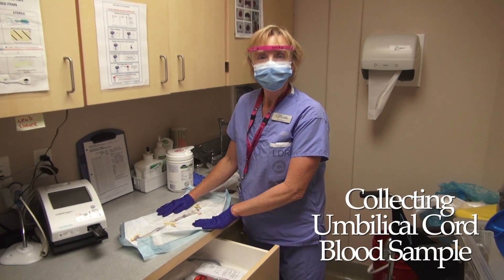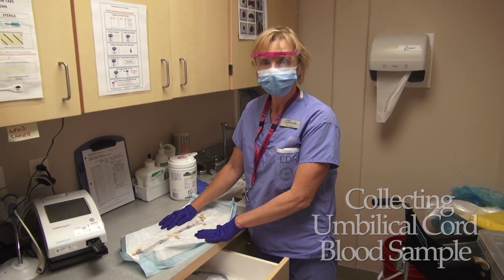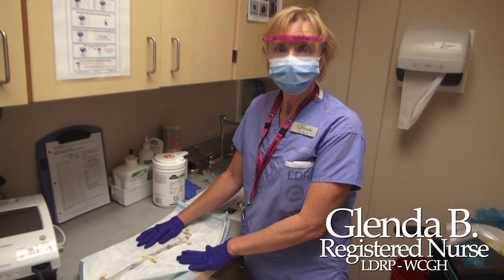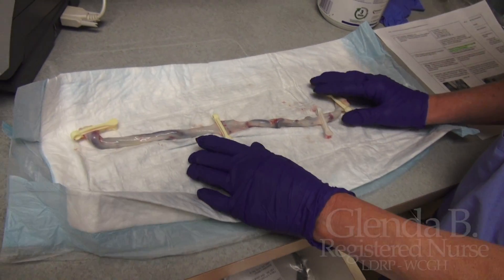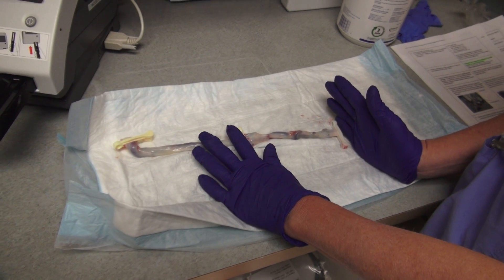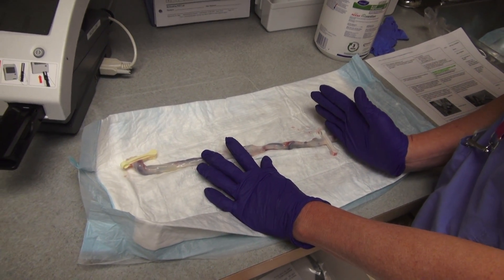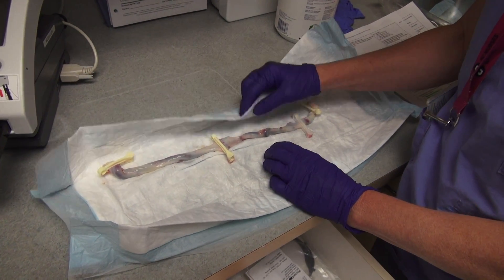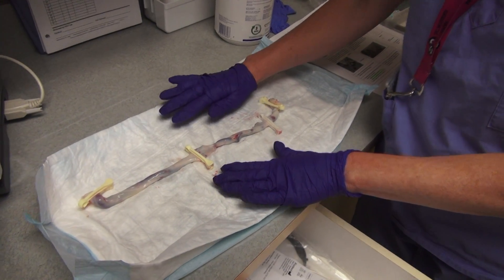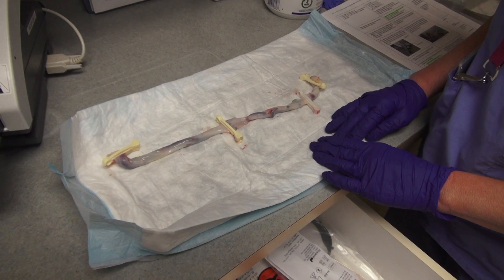Hello everyone! Thank you for taking a moment to see how you can help us collect an umbilical cord blood sample. I'm in the dirty utility room in maternity and I have a cord from this morning. When we collect a gas on all our babies, we always take a segment of cord and take it with a blood gas kit and bring it down to the lab so it can be processed. There are times where we might not be able to do it, and your help would be so appreciated.